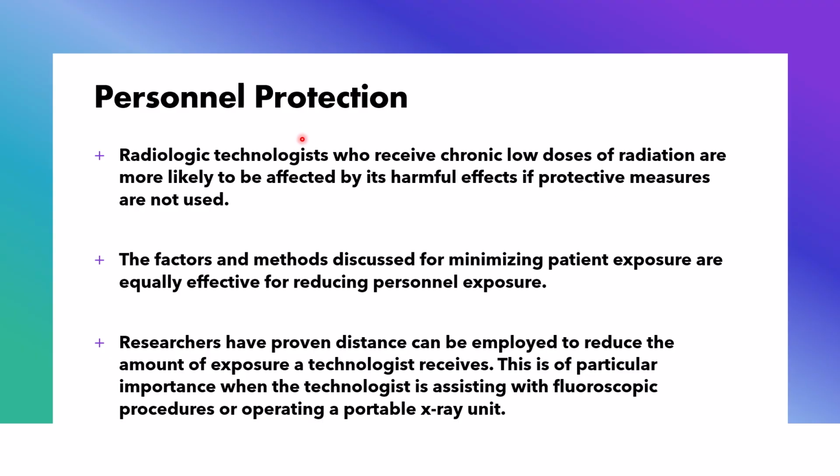Personnel protection. The radiologic technologists who receive chronic low doses of radiation are more likely to be affected by the harmful effects of the radiation. The factors and methods discussed for minimizing patient exposure are equally effective for reducing personnel exposure. So if we stay a little time in the room where an X-ray is being done, if we keep our distance, and if we use shielding, we're protecting ourselves.